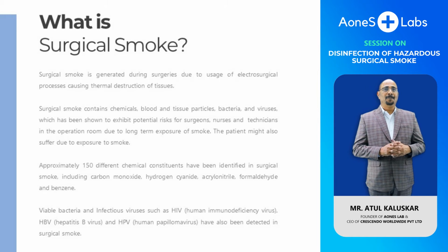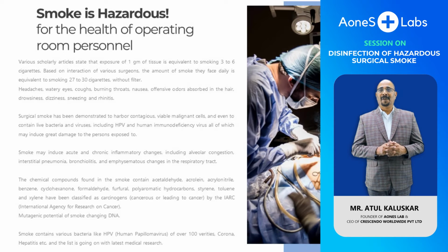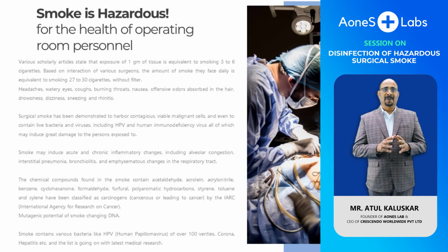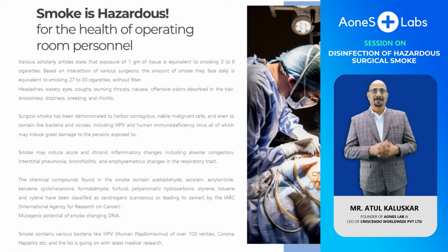In recent times, the probability of coronavirus passing through the smoke and infecting surgeons, anesthetists, and operation theatre team is extremely high. Though the effect of corona is not proven, whether it will affect the OR team or not, but again, the absence of evidence is not the evidence of absence.